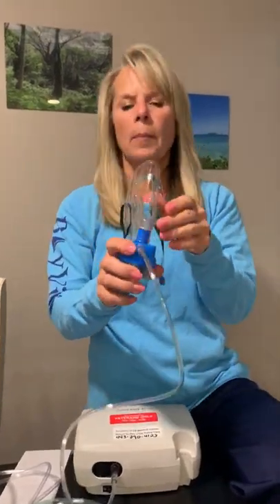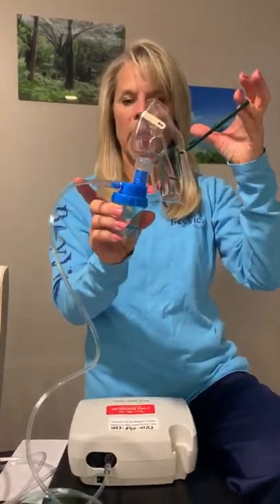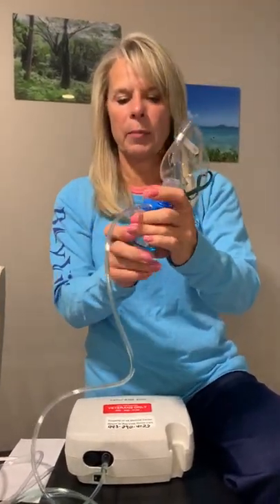This is going to be about taking the treatment with the face mask. It's put together like this — we already went through that part. You unscrew the bottom, or you can just take the face mask off, and you're going to pour the medication into the center here.